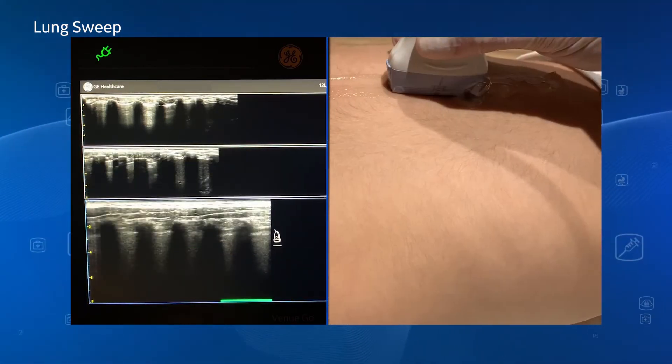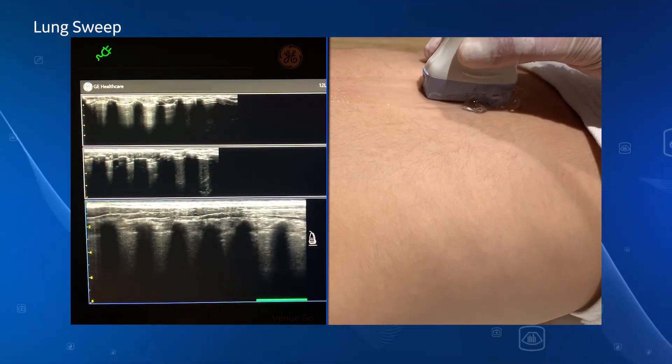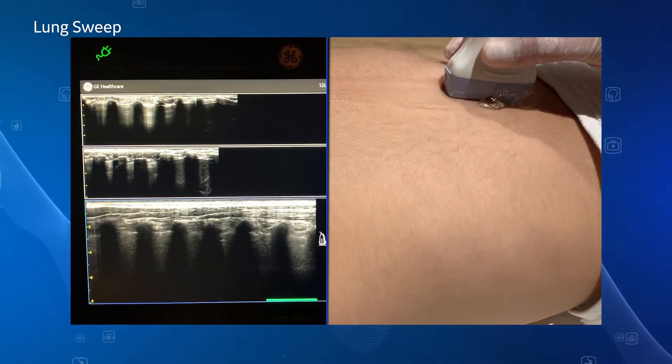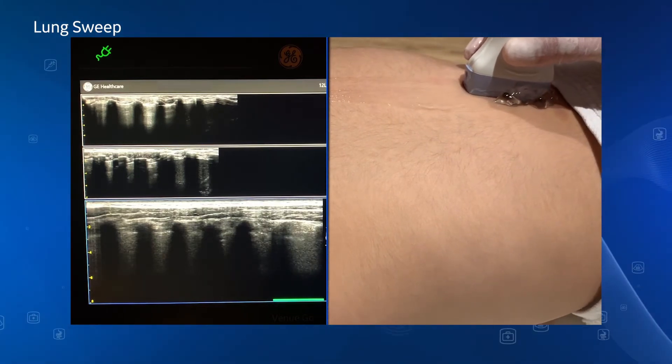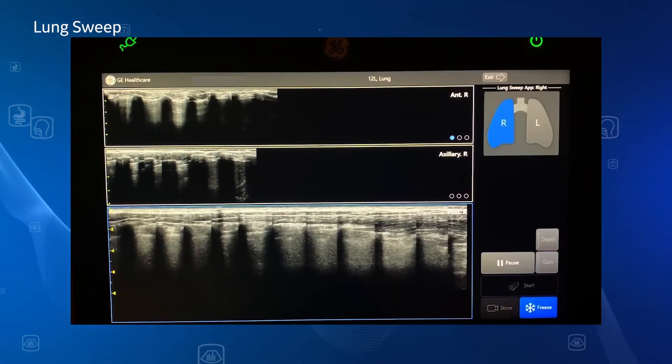After you have scanned all three sections of the lung, you have sufficient images in one view for a confident patient assessment.